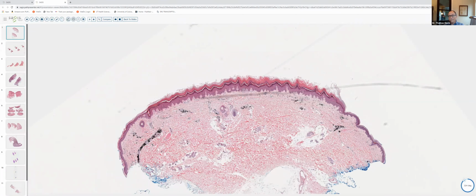In this particular biopsy specimen, what really should catch your eye is at the base of this piece of tissue. We've got this large collection of amorphous materials. So you want to make a mental note to go back and take a look at that. But looking at the other pieces first, again, one can see that the dermis here is a little bit fibrotic, and there are vertically oriented vessels, and there are no adnexal structures here, and slightly thickened collagen bundles.